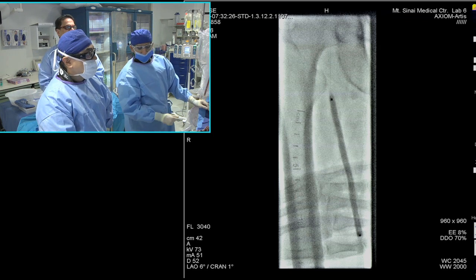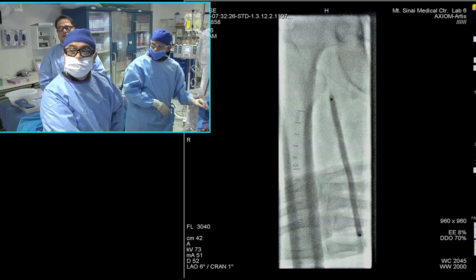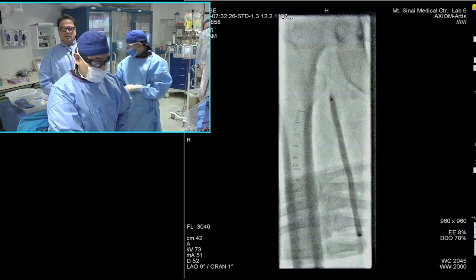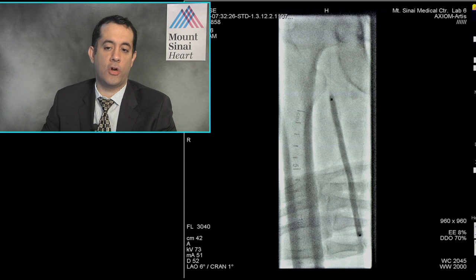So, yeah, it's very painful. Well, that's the wait and watch with the DCB. I know, that's the problem. So once you've done a DCB, and suppose you find a flow limiting lesion, or you're not happy with the end result, for spot stenting, where do we stand next?